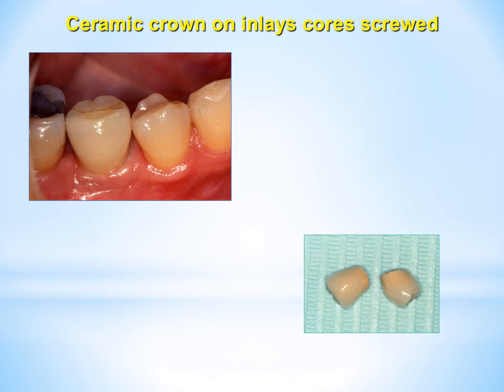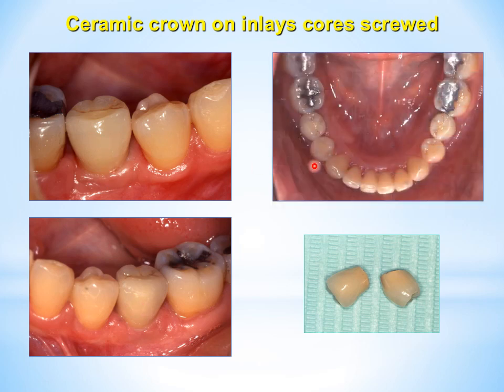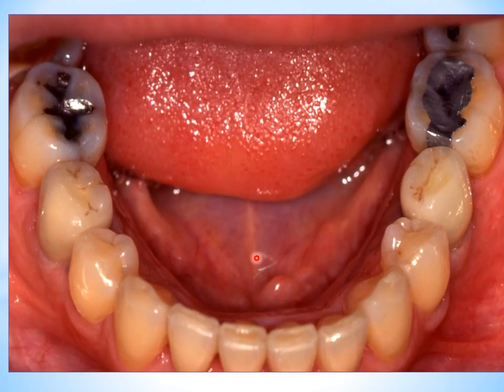Ceramic crown on inlay core screwed. We can see the crowns that are fitted in the patient's mouth after finished construction in the lab.